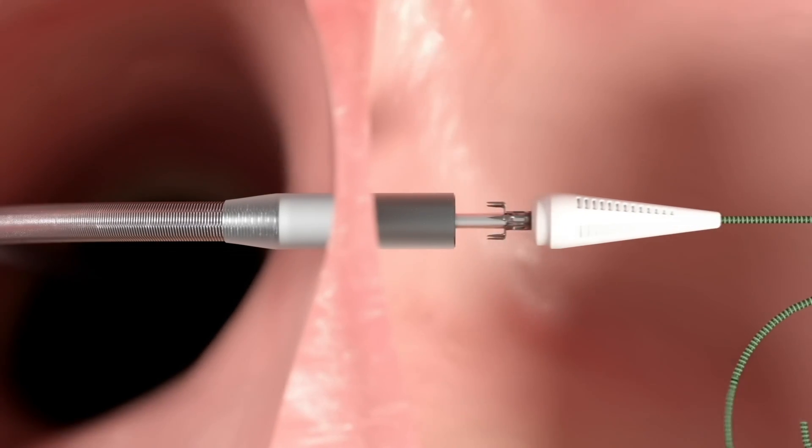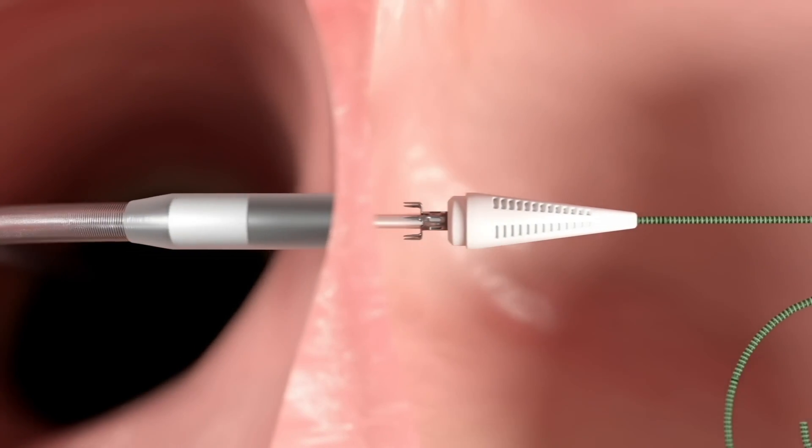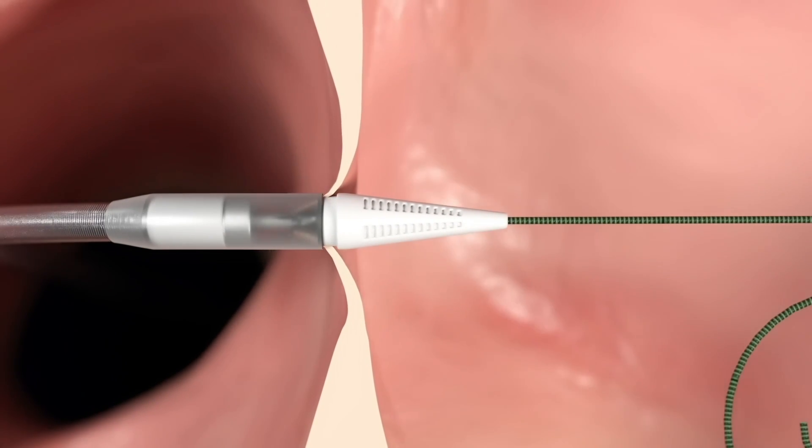The device is then opened and slowly retracted under image guidance until the electrode resides on the right side of the septum, while the tip remains on the left side. The device is then closed, firmly securing the tissue that will be removed within the device.